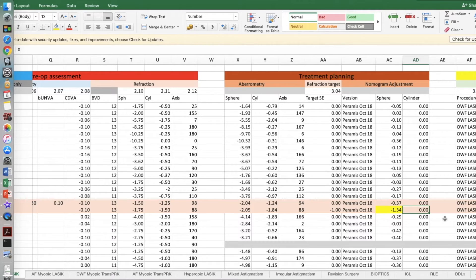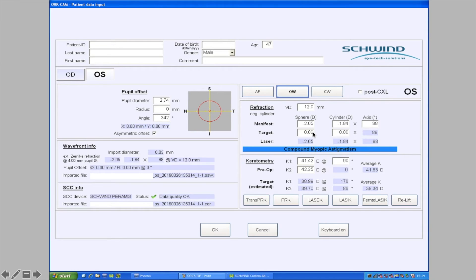For nomogram adjustments to the cylinder, we found we simply don't need them for the Pyramis system — any adjustments derived from regression modeling have been too small to be clinically useful. With some other systems it is useful to make cylinder adjustments as well, and we've laid out how to do this in the reference at the end of the talk. So we type minus 1.34 into the target sphere box and select Femto LASIK.